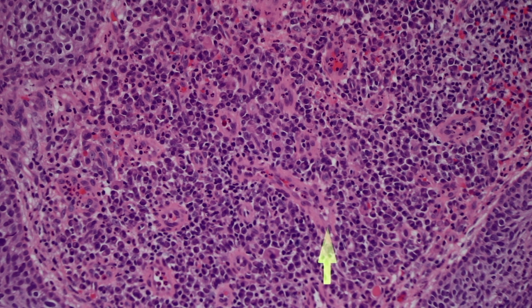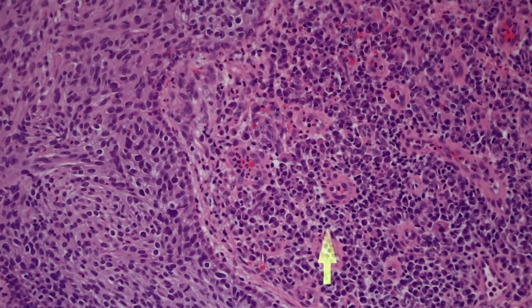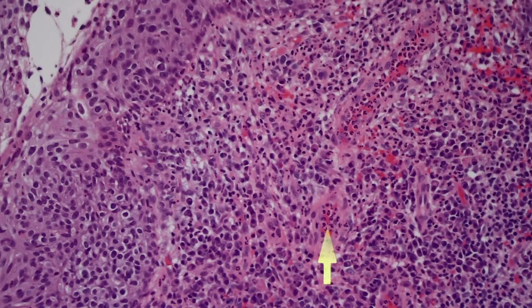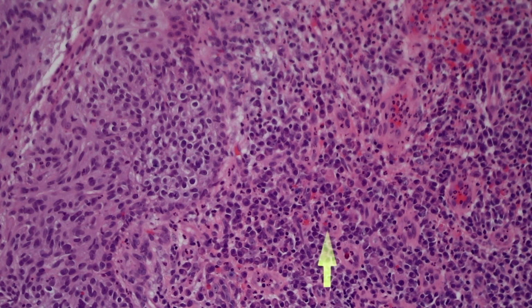I see myeloma in my practice, but I've never seen it next to a basal cell carcinoma or squamous cell carcinoma. I'm sure it'll happen eventually, but I've seen patients with known myeloma get skin involvement, and I probably see that more than a lot of people because of the center where I work. But we see regular plasma cells as a reactive phenomenon under basals and squams all the time. So honestly, when I see this, I don't do any additional workup. I don't even bother to mention it because I don't think it means anything clinically. It does freak out my residents sometimes, but once I point out how often this happens, they're like, oh yeah, I guess it is a common finding.